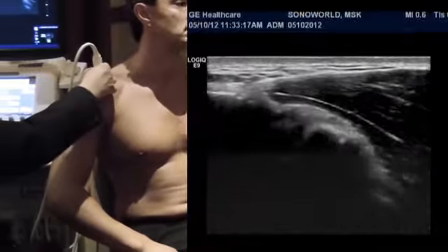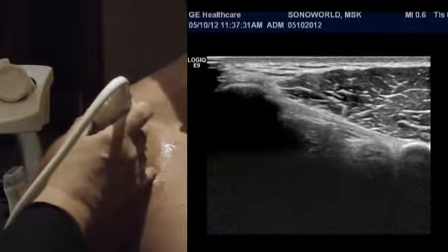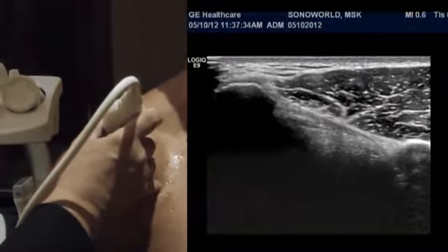We're going to identify the bone acoustic landmark of the coracoid and that of the acromion, and once we have the compact fibrillar pattern of the ligament, we can now examine the coracoacromial ligament. We're going to direct the probe immediately below this ligament, and now you can identify the rotator cuff.